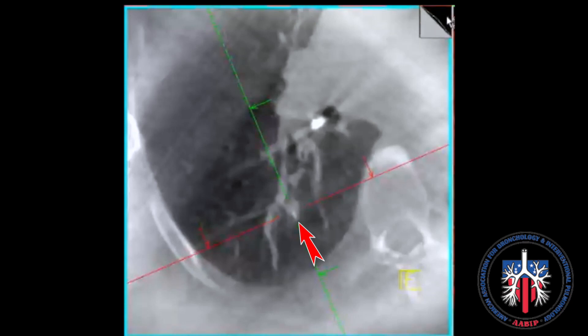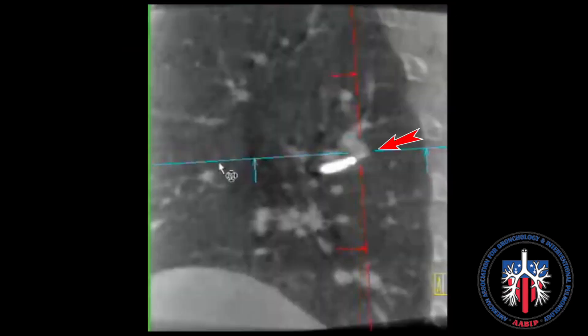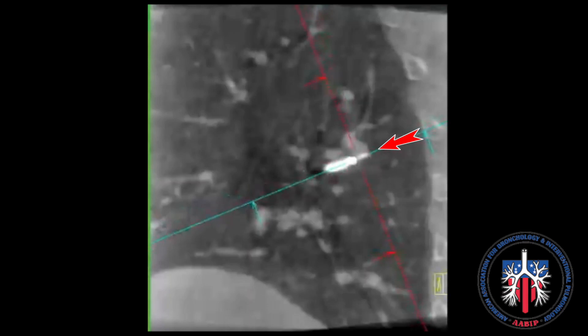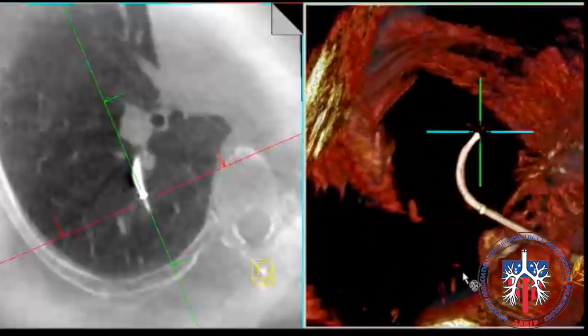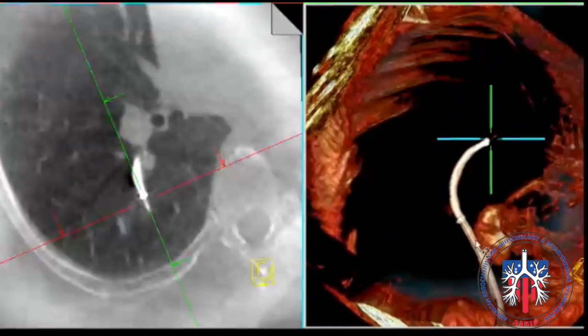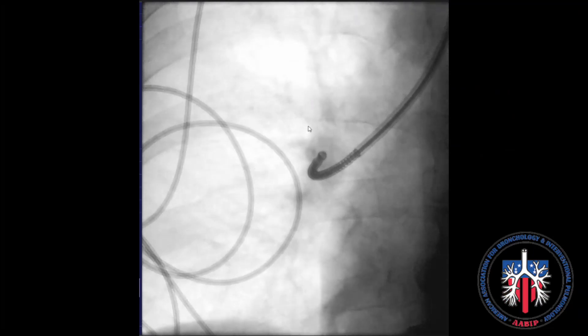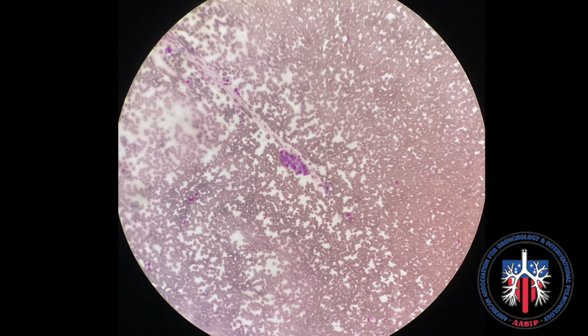Cone beam was performed and confirmed the tool and target on multiple cuts. An adjustment of the catheter to be more superior was performed in this case to be more concentric on the lesion, based on real-time imaging. When confirmed, biopsy was performed and confirmed with pathology during the procedure — four positive lesion samples.